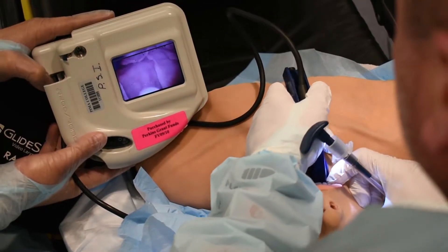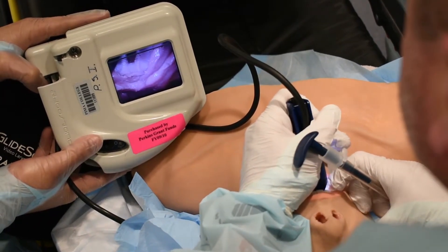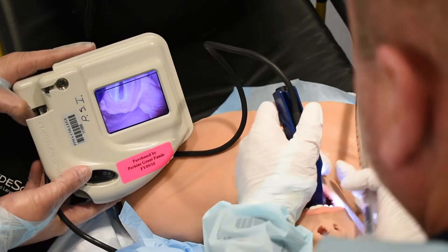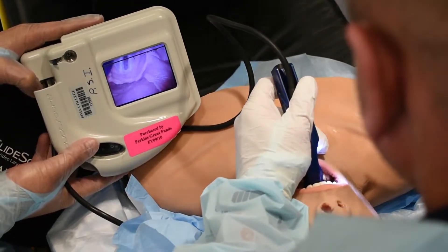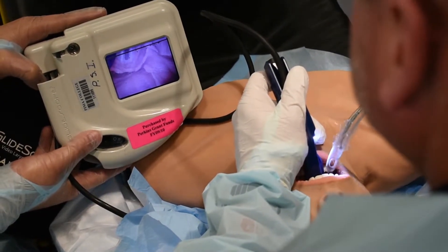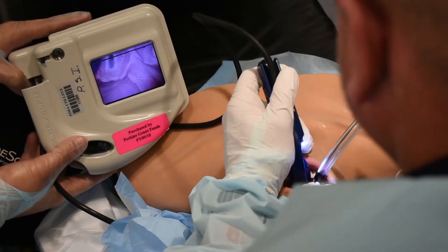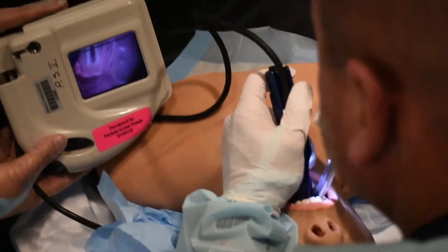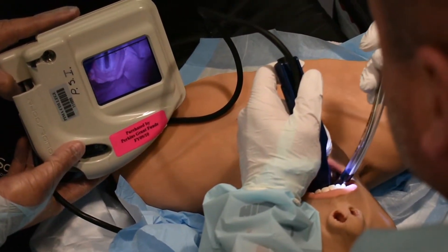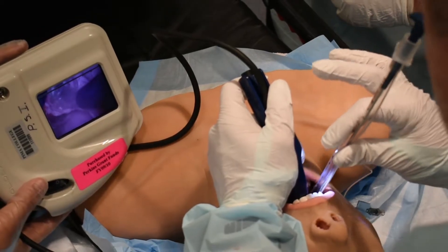As I rock my blade back, I get a beautiful view of the cords. That view is way too close; that view is way too far away — there's the epiglottis structure, so I want to get that ideal view. I take my tube, come from the right, making sure my cuff does not hit their teeth — especially in a traumatic event, as teeth can rupture your cuff. As I come down, it will hit the posterior pharynx. My view is 100% on the screen. I start rocking my tube back and guide it directly into the vocal cords without smashing the teeth.